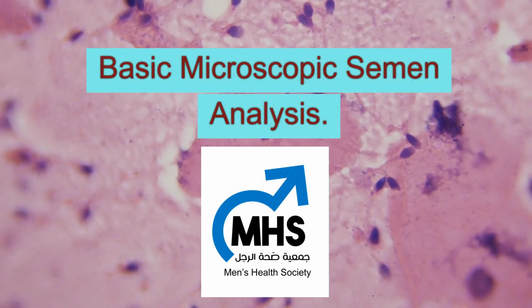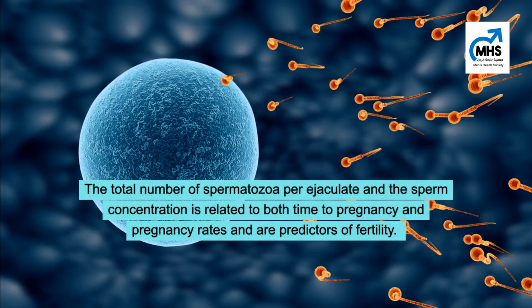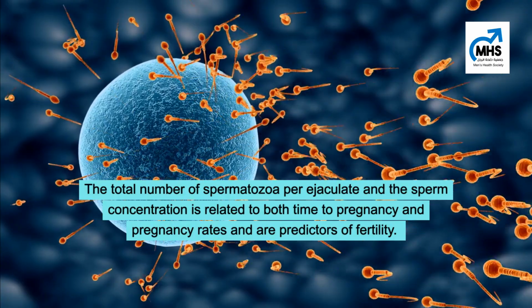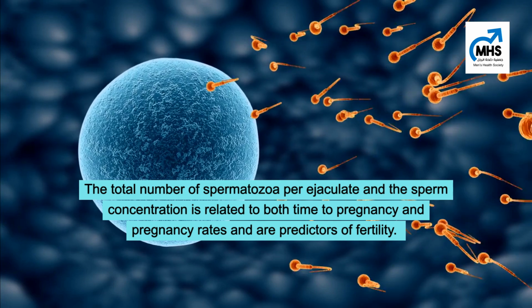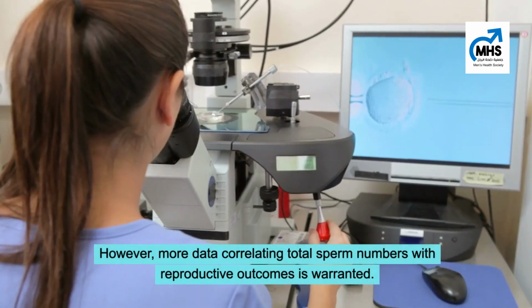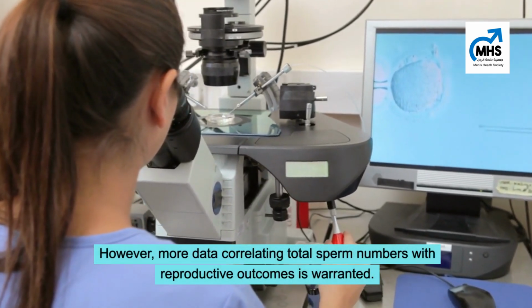Basic microscopic semen analysis. Sperm count. The total number of spermatozoa per ejaculate and the sperm concentration is related to both time to pregnancy and pregnancy rates, and are predictors of fertility. However, more data correlating total sperm numbers with reproductive outcomes is warranted.